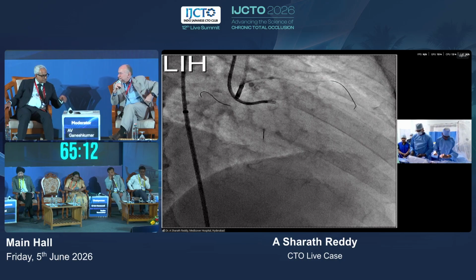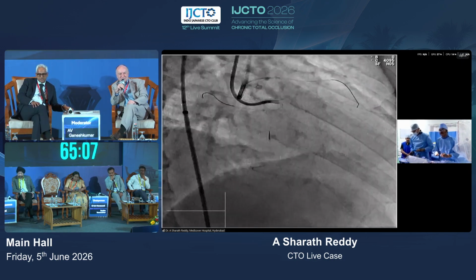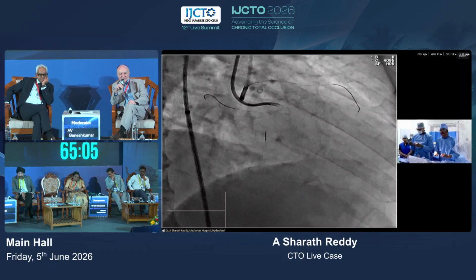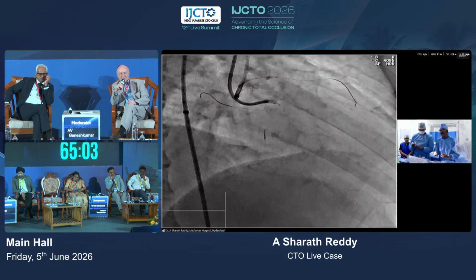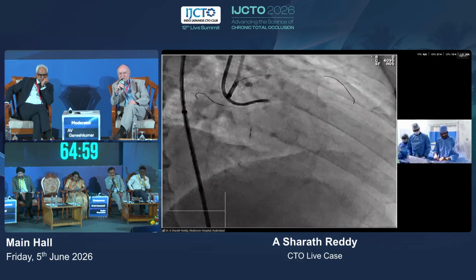I think we stay a little bit with you for another 3-4 minutes, because that is an important step, and it's sometimes good to have a live step in a live transmission and not fluoro storage.